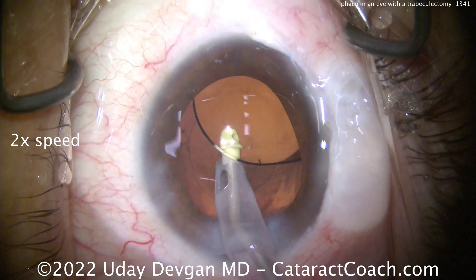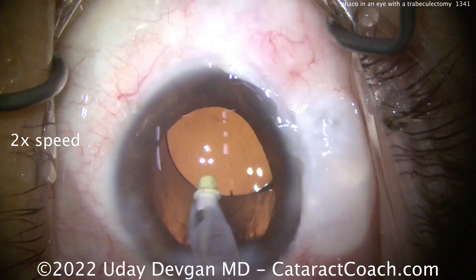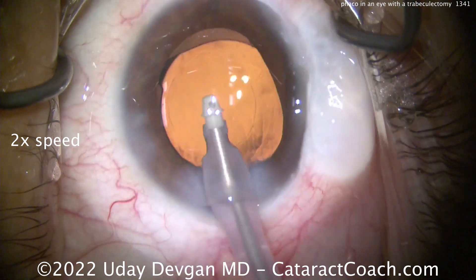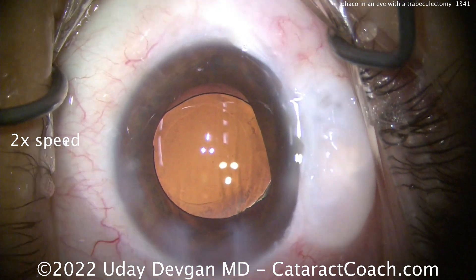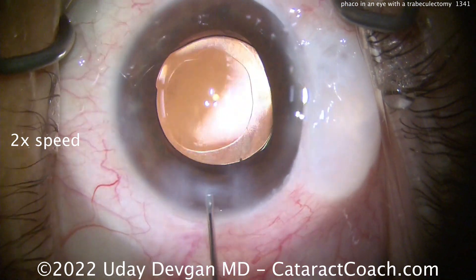Take out all the viscoelastic — don't leave viscoelastic in this eye because you don't want a post-op IOP spike. There's behind the lens — there's that rhexis. As you can see, it's on the small side as we designed at the beginning. Let's get out all the viscoelastic, including in that area near the bleb, and wash that out too with BSS on the cannula.